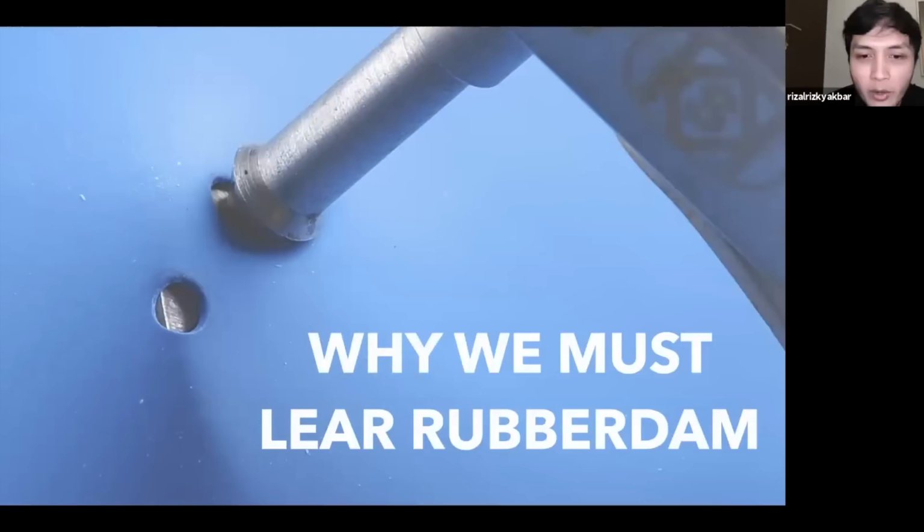Why we must learn about rubber dam? Actually, there are so many reasons why you have to learn about rubber dam. You can search it online. You can search it in the literature, in the book. I think there is so much literature that supports us to use rubber dam and recommends us to use rubber dam.